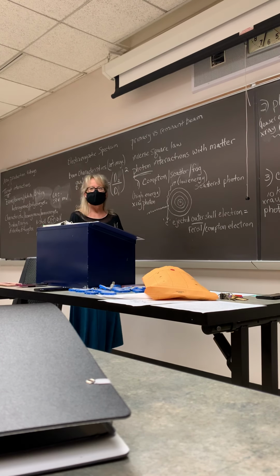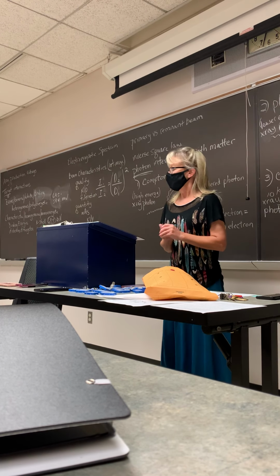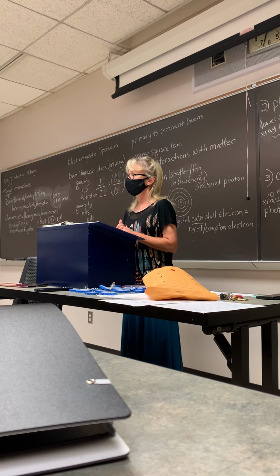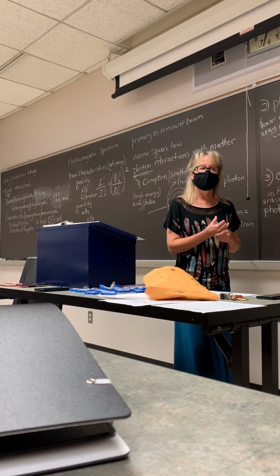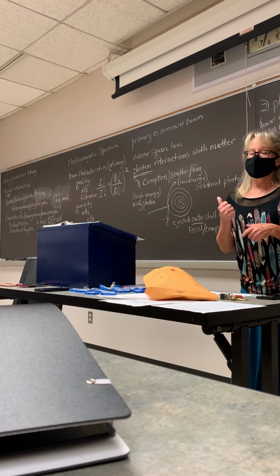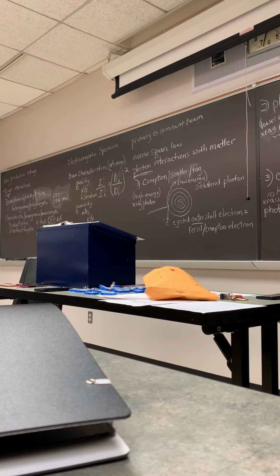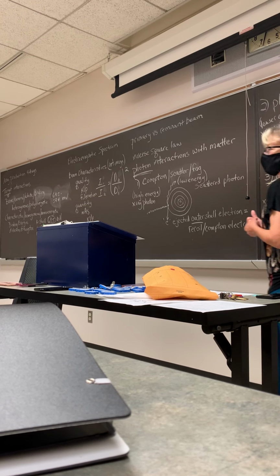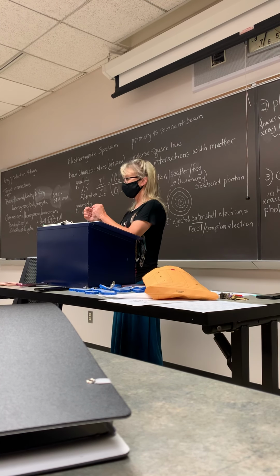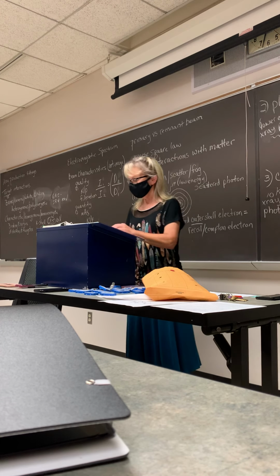What's the anode made out of? Tungsten. Good, tungsten. So is the cathode, right? So is the filament. It's made out of tungsten. Why do we use tungsten? It has a high boiling point. Good, high boiling point, and it's very strong, high atomic number. And in the case of the cathode, you can make it into a thin little wire, which is what the filament is.